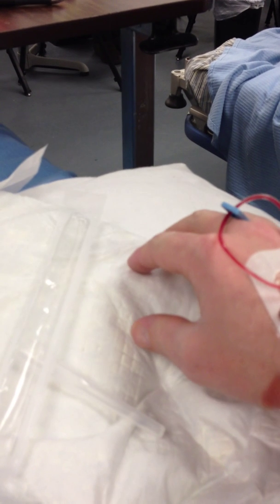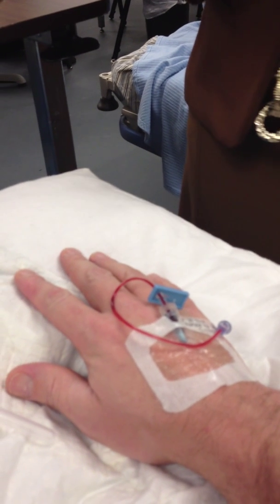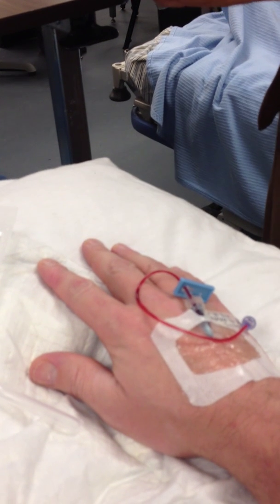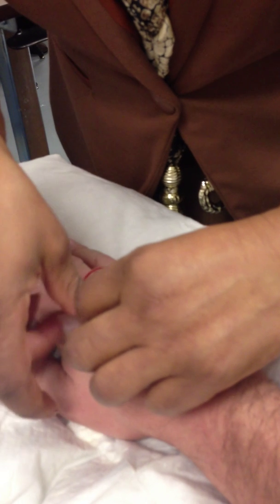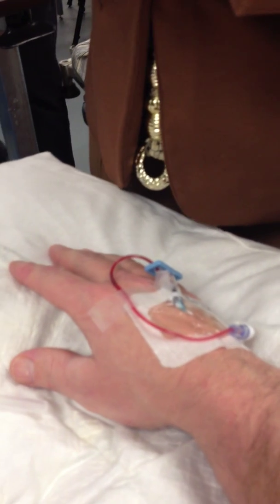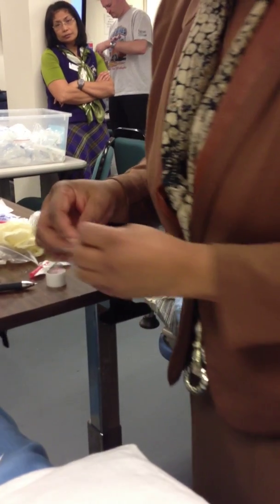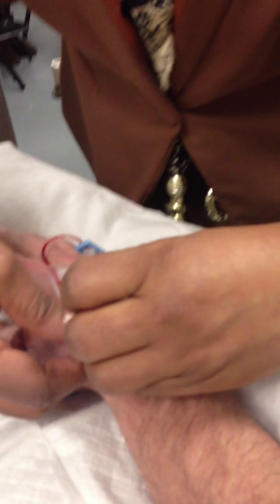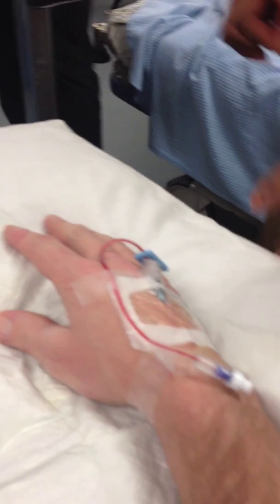And for now, with the tape you want to secure for safety — make sure it's not pulled out. I wouldn't leave the blood in there, so I didn't get an extra syringe to flush it off. But I wasted that saline so we can get a clean specimen with pure blood for the CBC — complete blood count. So, I put a little piece here, and I secure it up here. You kind of loop it a little bit around the tube so if it gets caught on anything, it'll pull away from there instead of pulling the IV out.